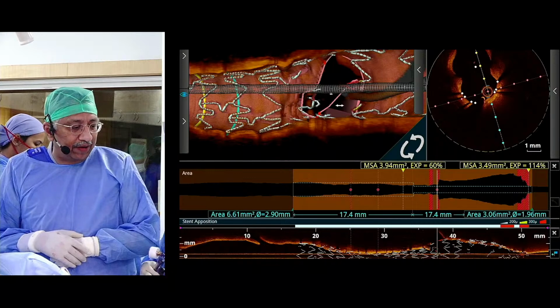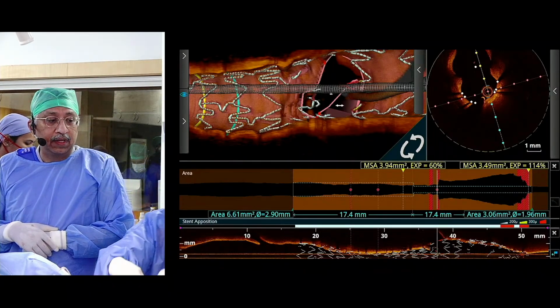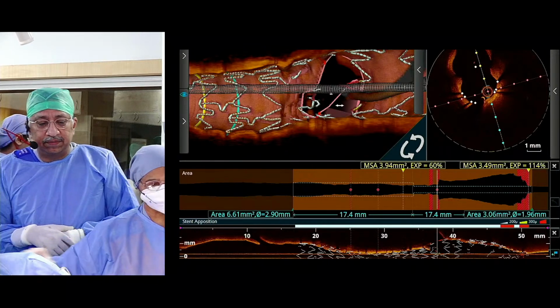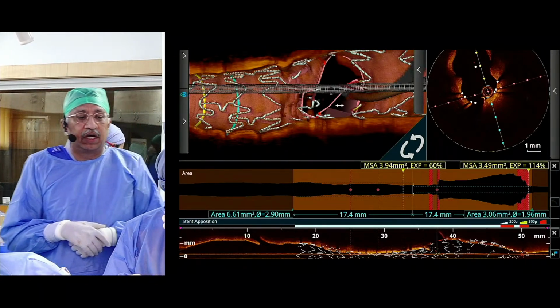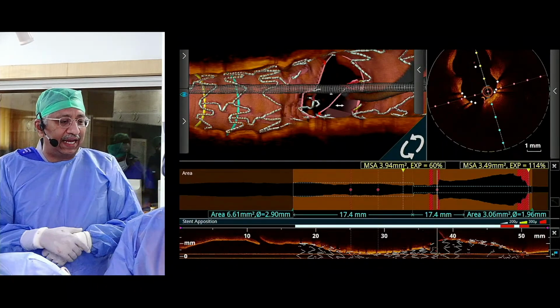So I think if you have time, do you use your OCT? Do you use the OCT to size that balloon? Yes. Is it an undersized balloon? Yes, into the circumflex it is an undersized balloon. 2.5, do you want to change to 2.7? First 3.5 in the LAD.